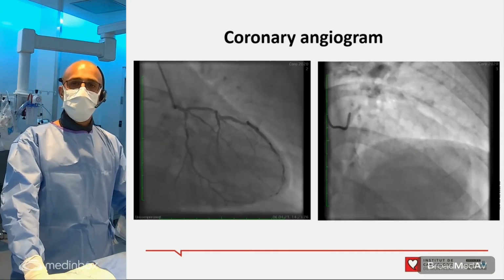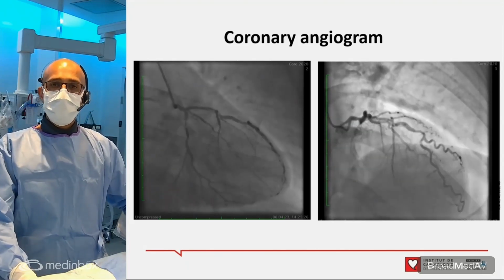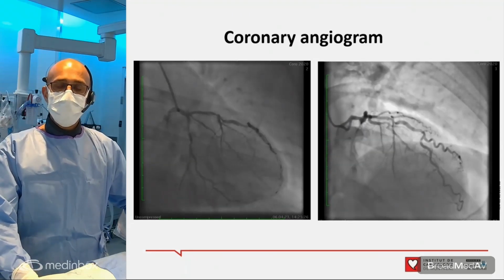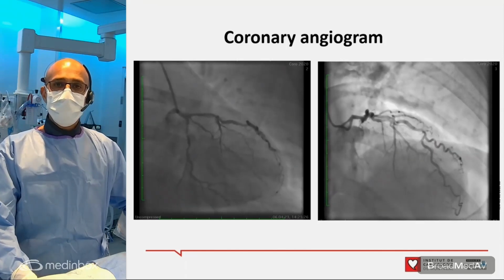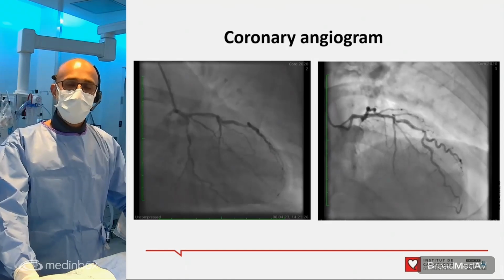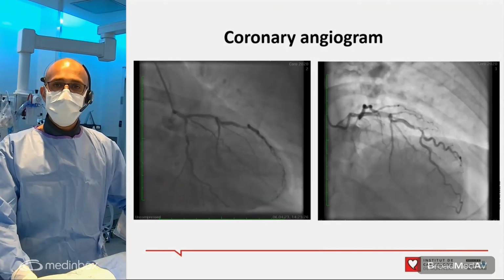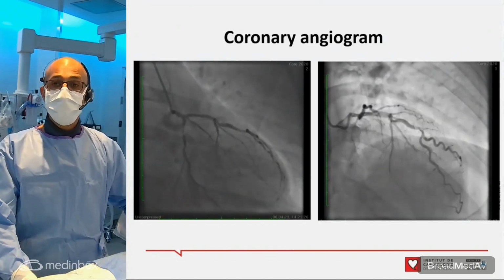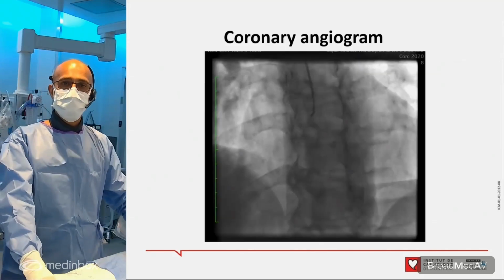So here you'll see the coronary angiogram of the left system, and it's very characteristic of radiation-induced CAD, where you have mostly proximal disease. So if you look at the left main, it's diffusely infiltrated, but mild disease. There's a proximal circumflex significantly diseased, and the LAD, it's tortuous and multiple levels of stenosis. Next slide, please.